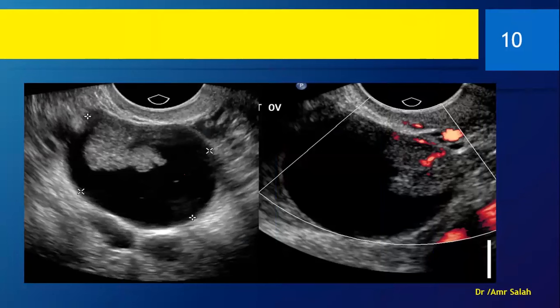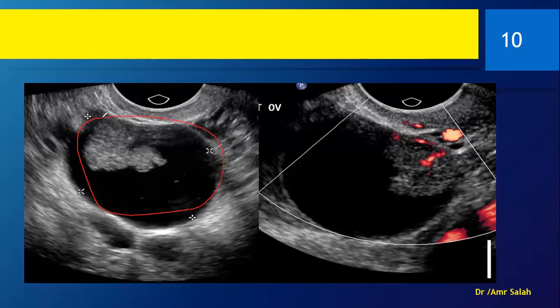Here we have a complex lesion — a complex cystic ovarian lesion that has a clear cystic part and a solid part inside. Is this a hemorrhagic cyst, a clot, or a tumor? What we do is activate the Doppler. If there is vascular flow, then voilà — this is a tumor.